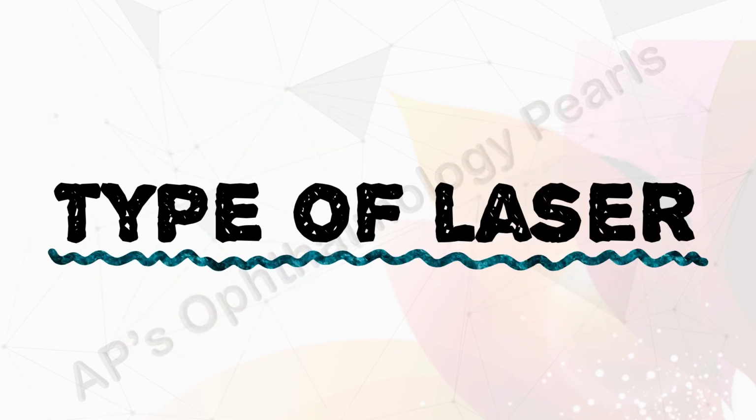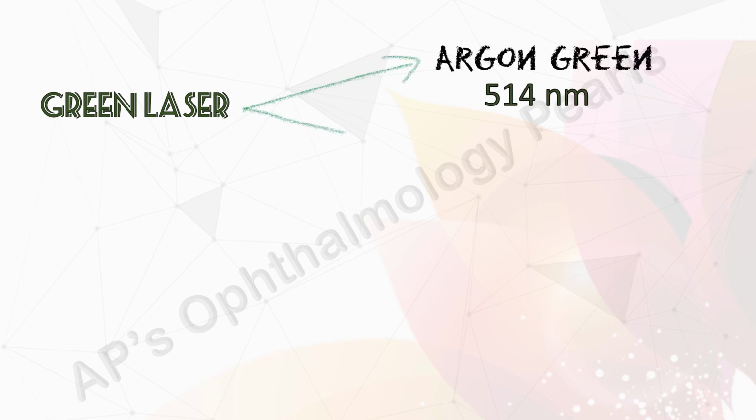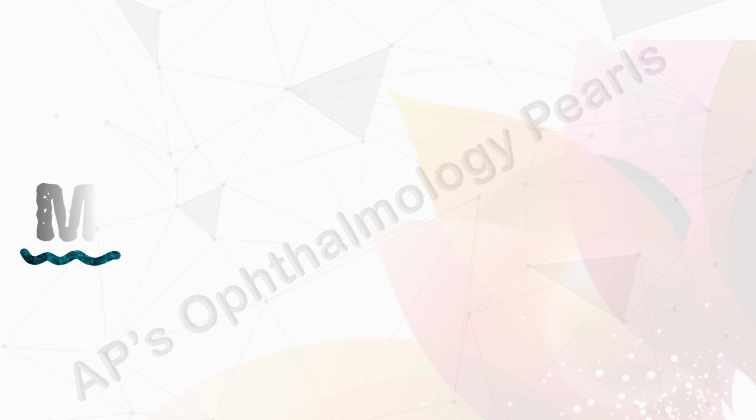For retinal laser photocoagulation, green laser, either in the form of argon green or frequency doubled YAG laser, is the predominant type of laser used, as it has excellent absorption by melanin and hemoglobin with relatively poor absorption by xanthophylls, thus sparing potential macular damage. Diode laser may also be used.